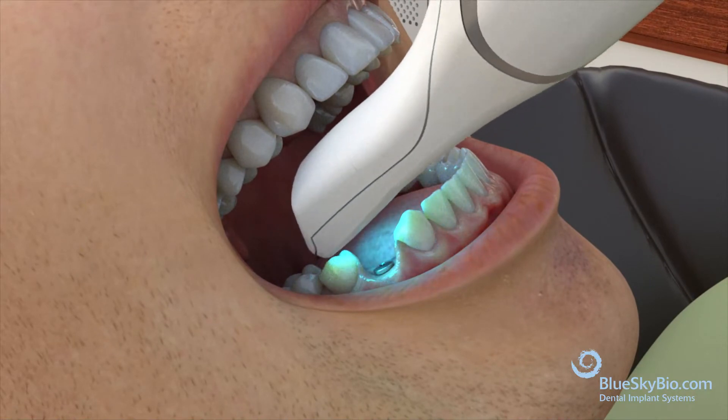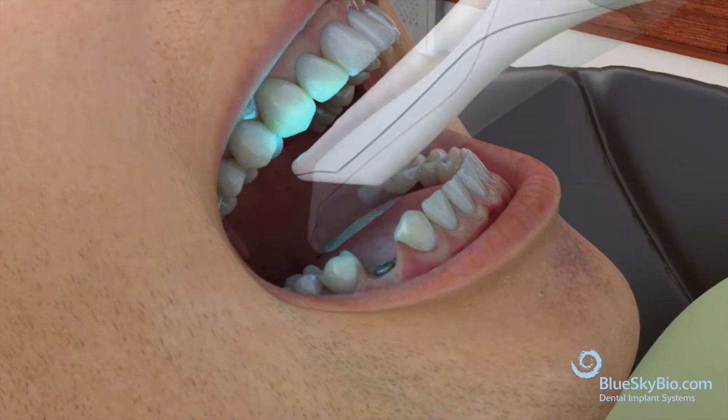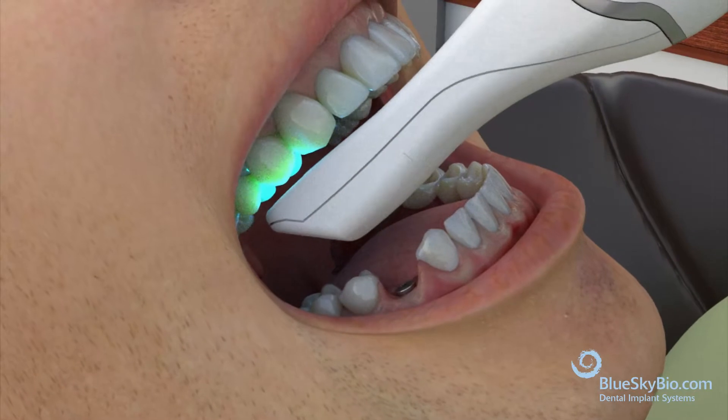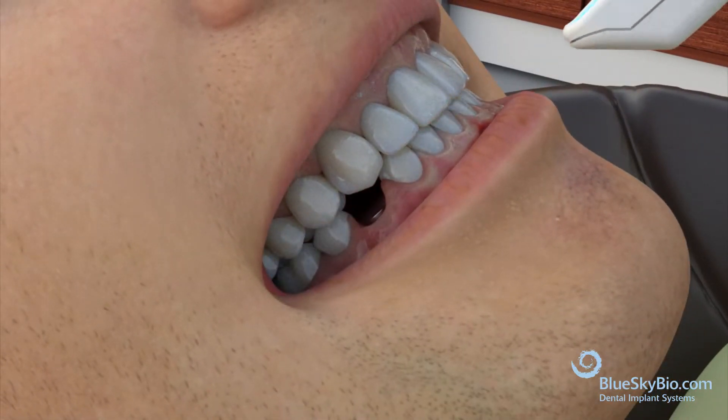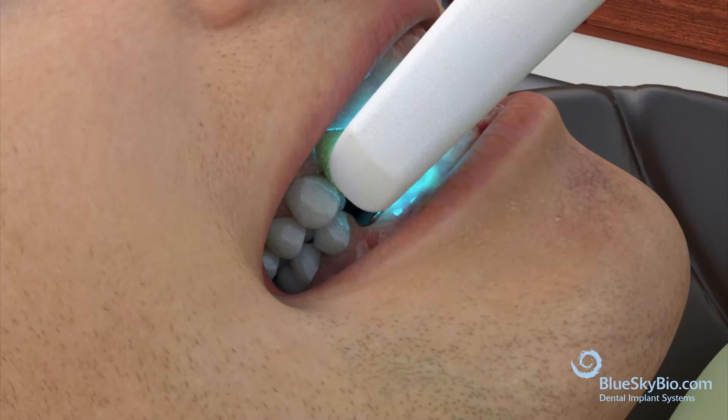Start by scanning the soft tissue. Next, scan the opposing arch and then the bite. This step must be taken with the patient seated at a straight angle while indicating to the patient to clench.